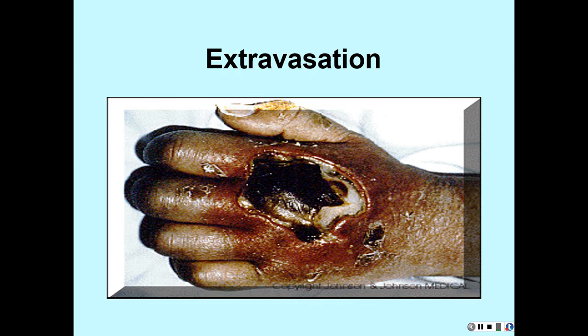Okay. You're going to assess and say, do I have good blood return? Okay, and is it flowing pretty easy? If your catheter is out of the vessel, you do not get a blood return, okay, and your fluids don't just flow in really easy.